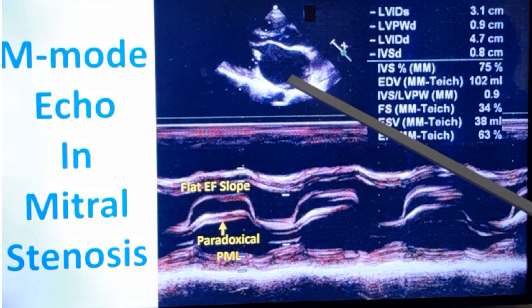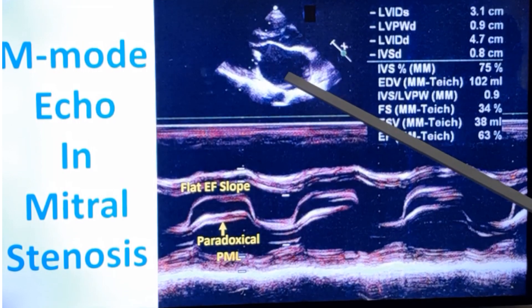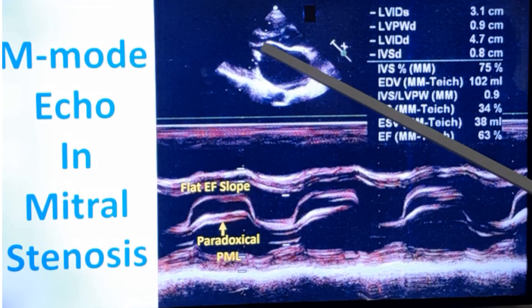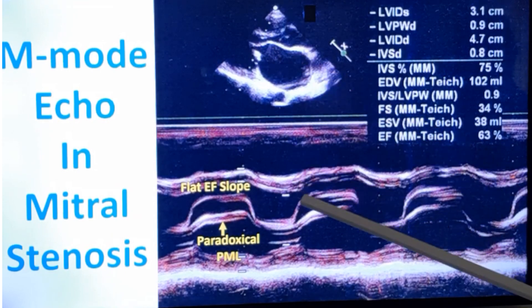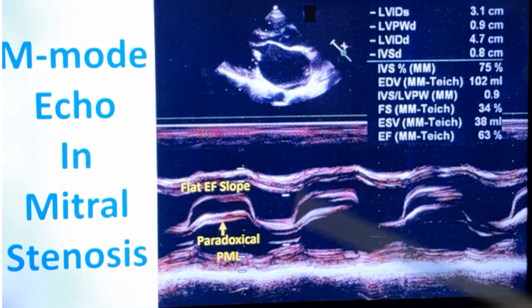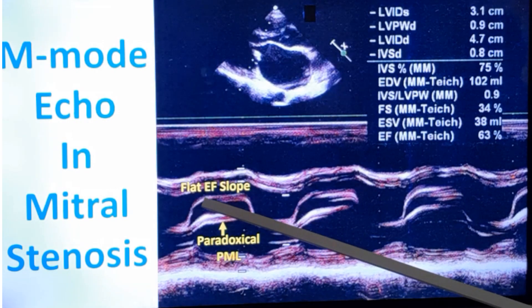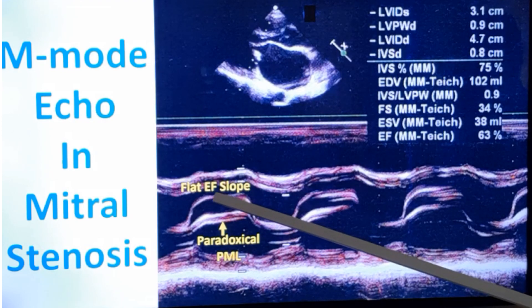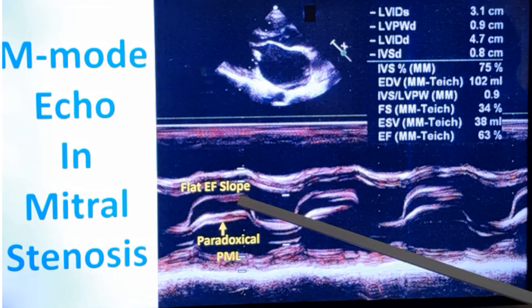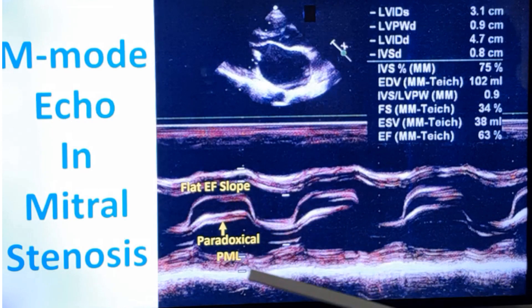You can see the left atrium is dilated in this case of mitral stenosis. There is calcification of the posterior mitral leaflet, which is moving paradoxically, and the anterior leaflet of the mitral valve is doming. These same features are seen in the M-mode echocardiogram as well — the doming corresponds to the anterior motion of the mitral leaflet. The flat EF slope is also seen.